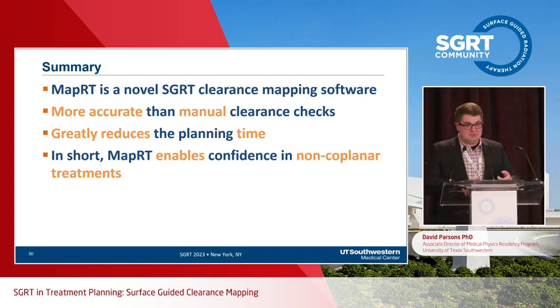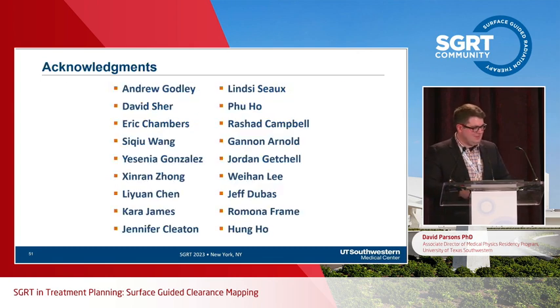So in short, if I had to put it in a sentence, MapRT or any collision mapping software gives you the confidence to do non-coplanar treatments, which in the opinion of UT Southwestern is how you do SABR treatments in a safe way.